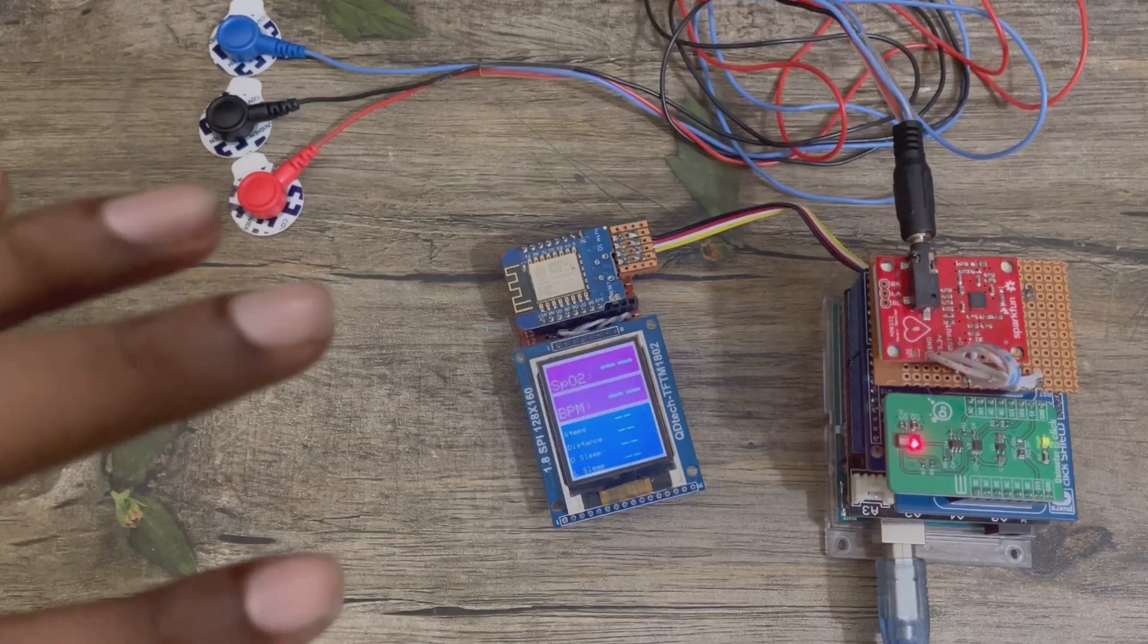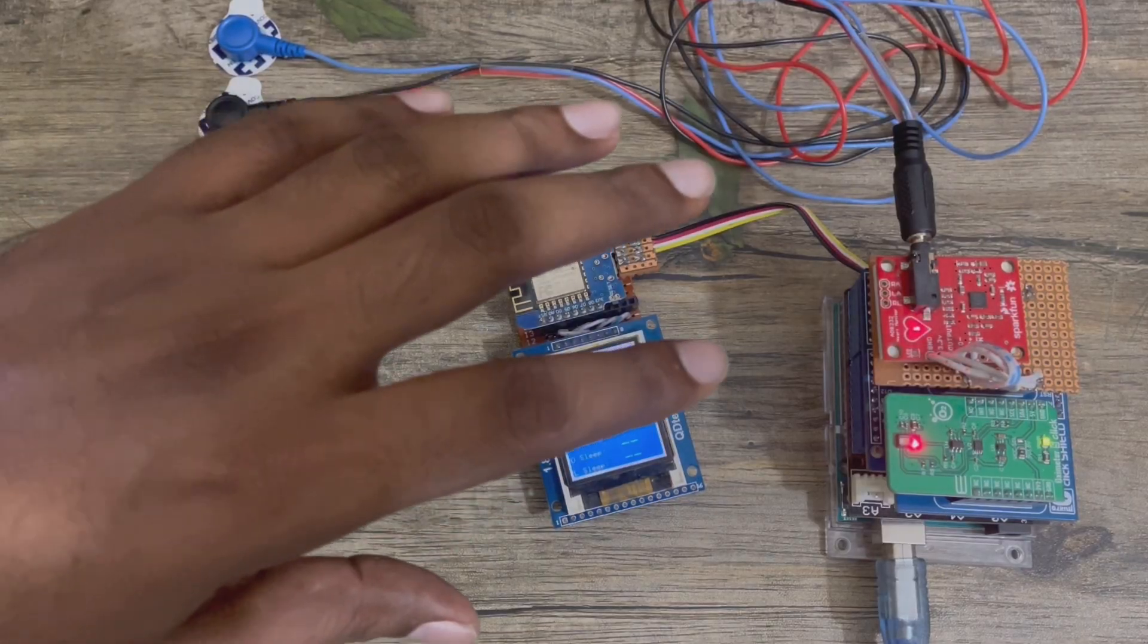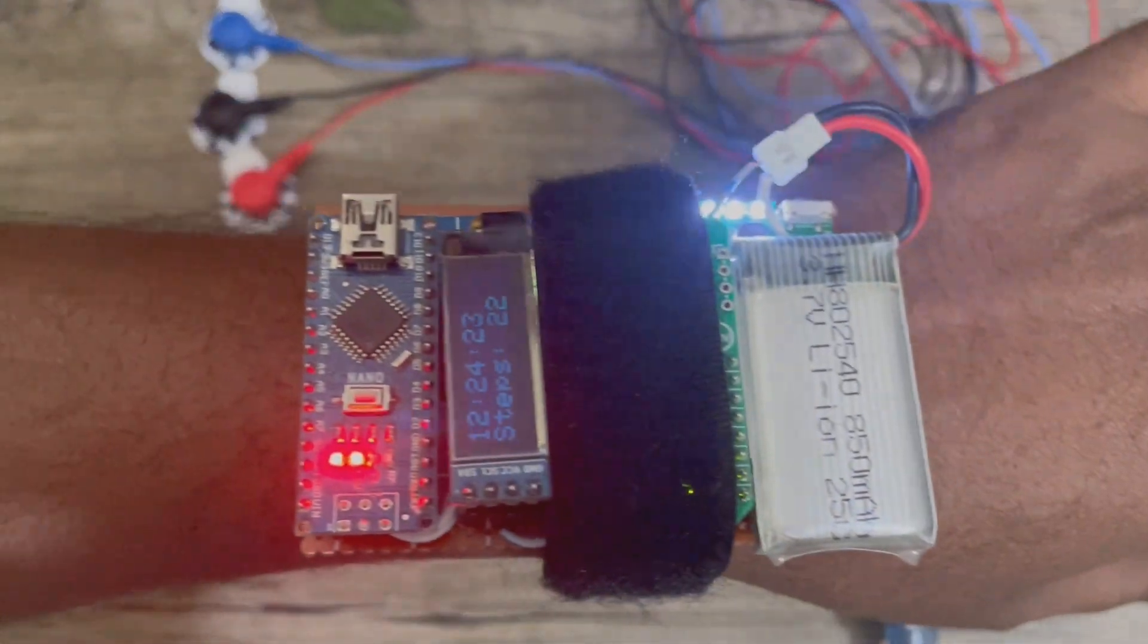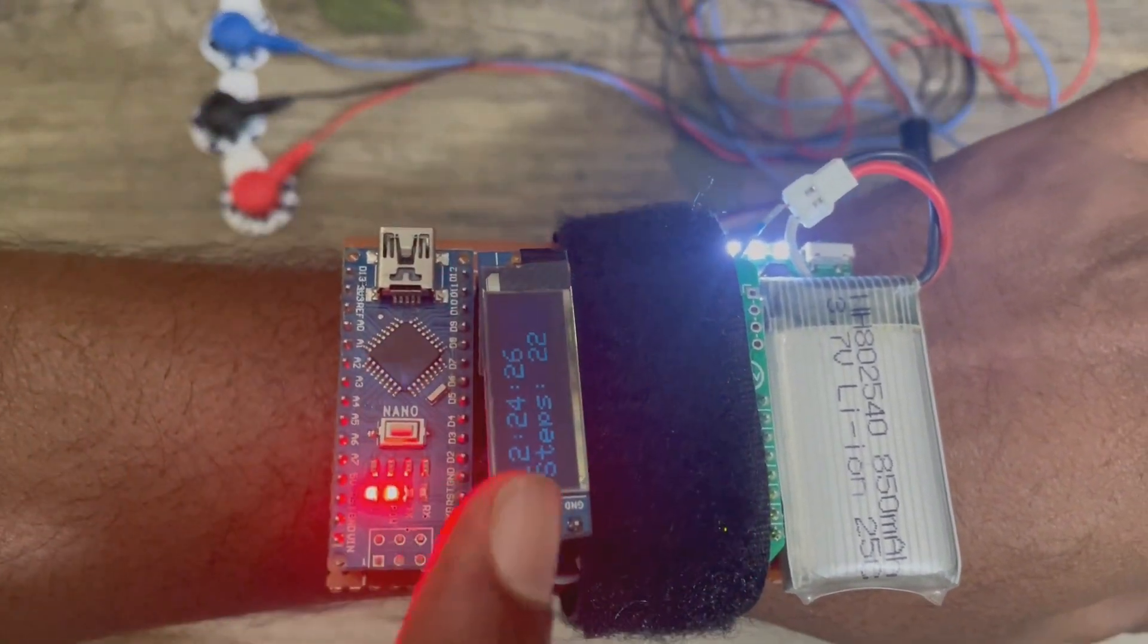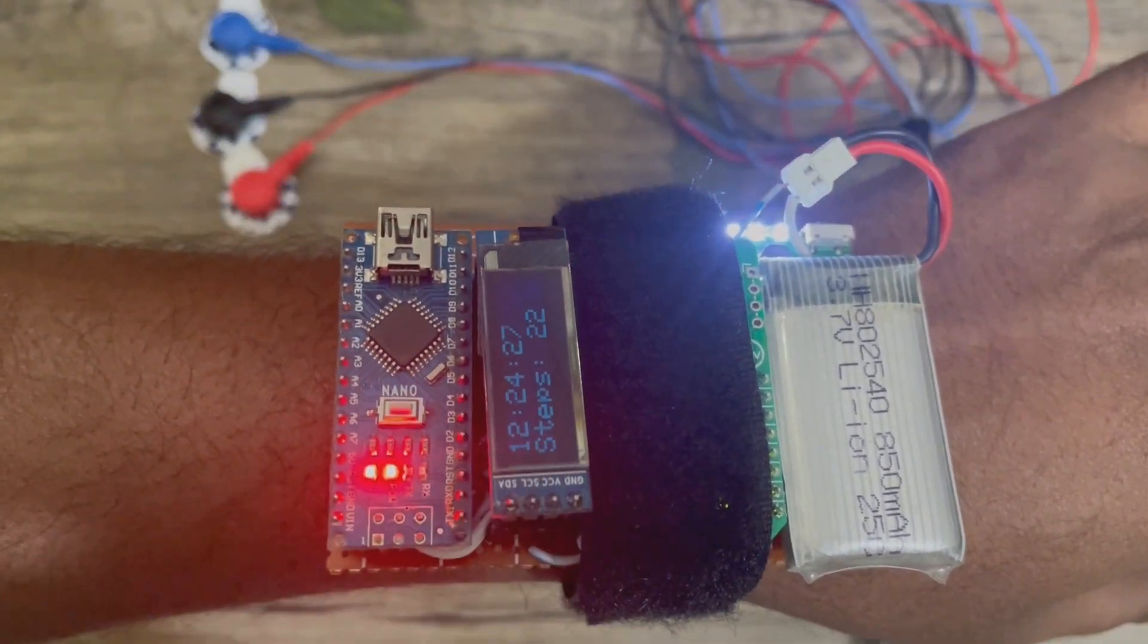Now the full system is running. The wearable unit is on my hand and it's showing the time and number of steps I have completed.